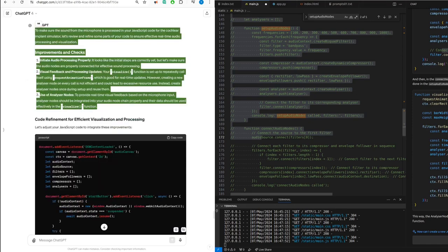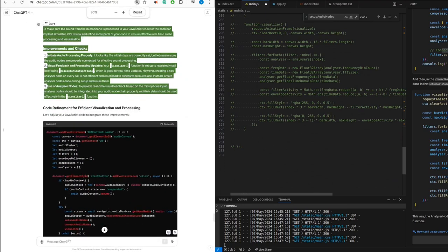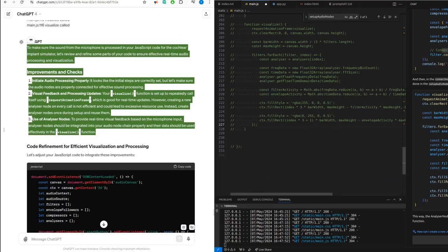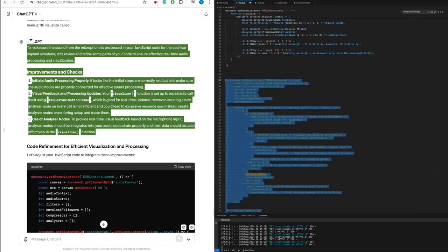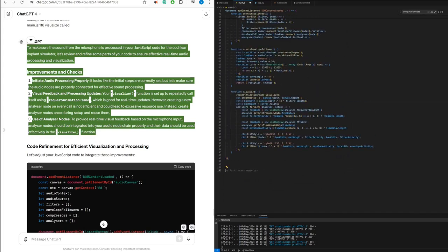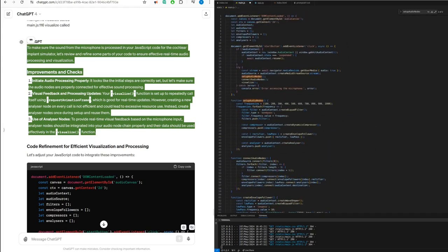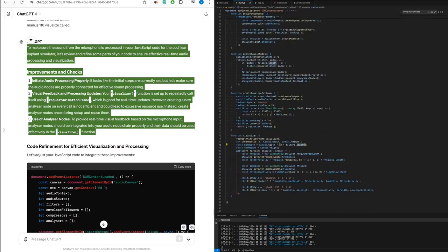Improvements and checks. Initiate audio processing properly. It looks like the initial steps are correctly set, but let's make sure the audio nodes are properly connected for effective sound processing. Visual feedback and processing updates. Your visualize function is set up to repeatedly call itself using requestAnimationFrame, which is good for real-time updates. However, creating a new analyzer node on every call is not efficient and can lead to excessive resource use. Instead, create analyzer nodes once during setup and reuse them.